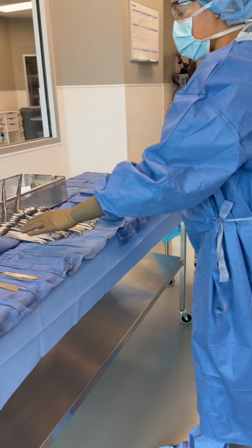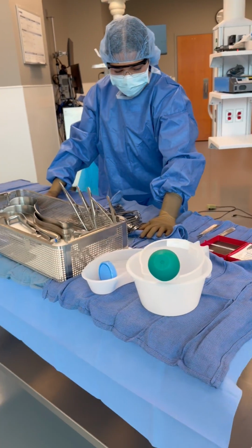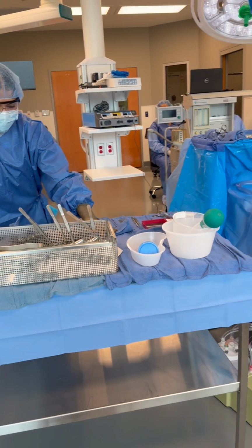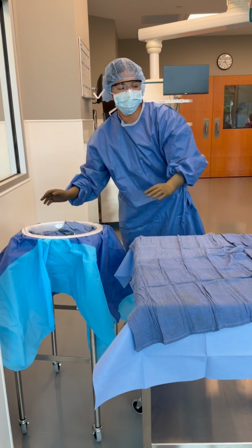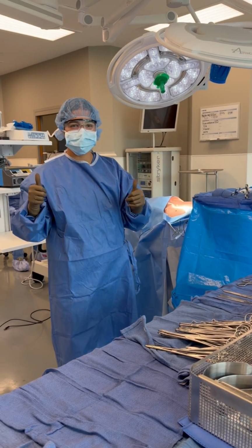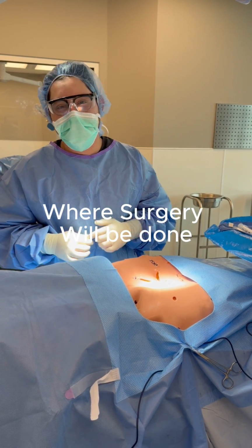And then I'm going to bring the back table next to the Mayo stand. And then I'm going to bring my basin over here to block traffic. And that's it.